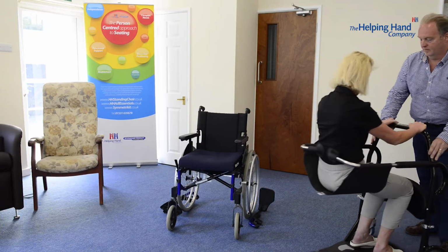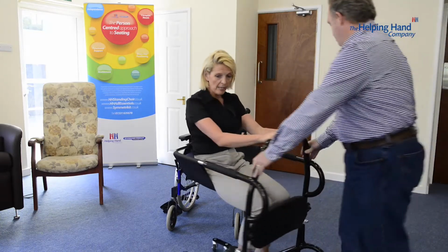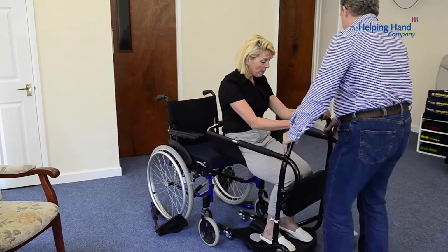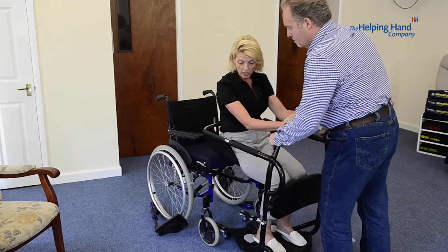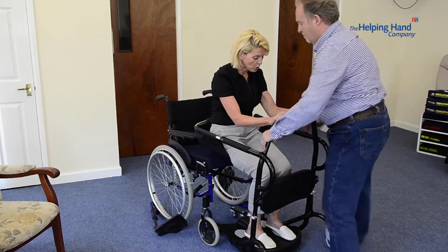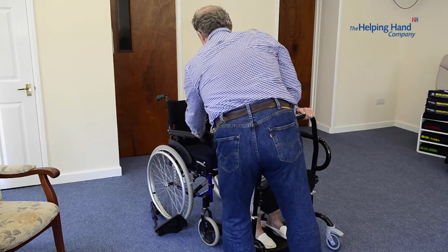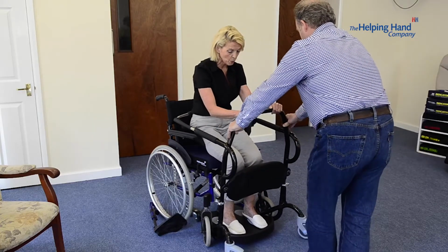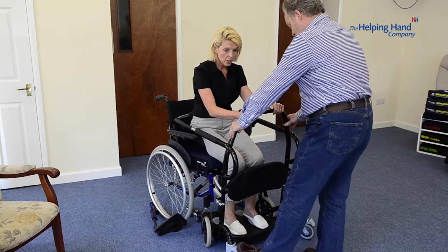So here we are coming back. The wheels on the cricket are a little bit like a shopping trolley. You just need to centre them. With the narrow wheels at the back, push straight in through to the wheelchair. You may need to slightly raise the bottom just as you're raising to come back onto the wheelchair. Pushing all the way back in so I don't have to adjust my position.